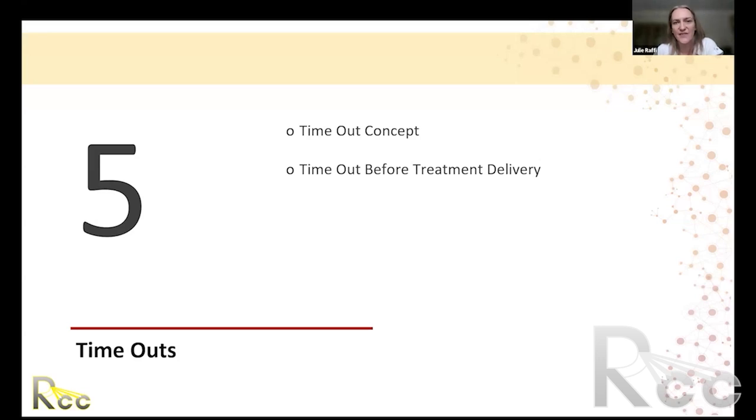Imaging frequency for setup verification is going to depend on your treatment site, the margins you're using, and your imaging technology. So that's something you need to discuss with your physicists and physicians and come up with a plan for each treatment site to know what's appropriate. At the beginning, you might want to acquire more imaging over subsequent days to make sure it's consistent, before you maybe reduce imaging frequency to once weekly for that site, once you know what your established patterns are and how consistent your setups are from day to day. That's definitely something to work out with the whole team when you're adding IGRT.